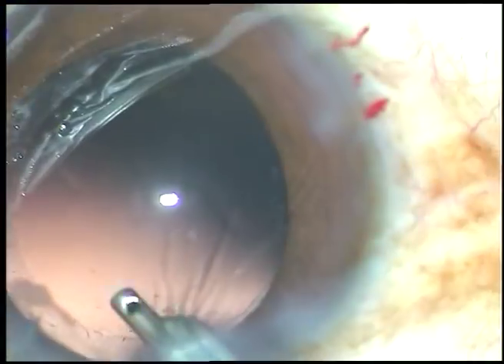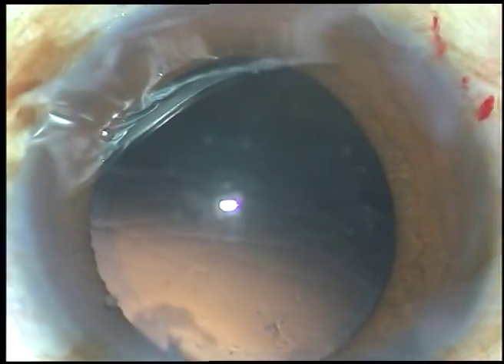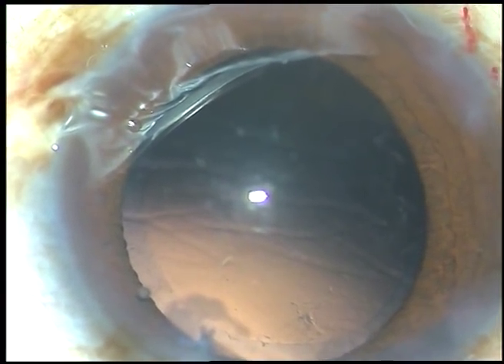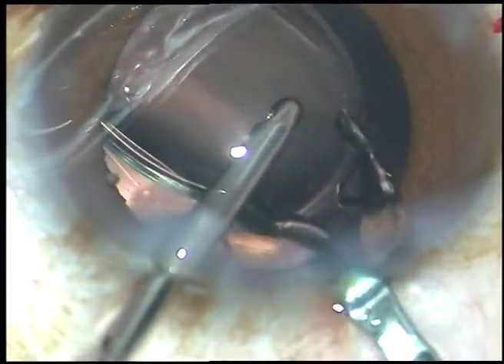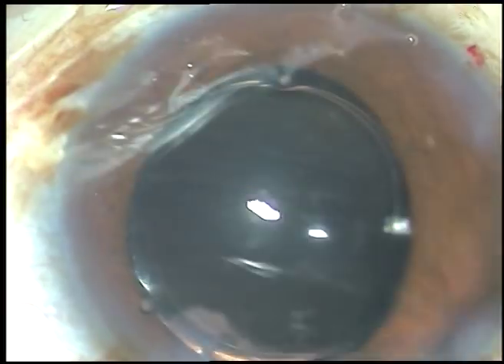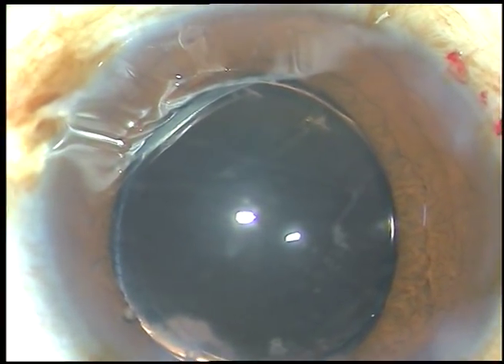In this case, we have selected a hydrophilic acrylic intraocular lens, and it is being implanted under irrigation. Irrigation keeps the anterior chamber formed and the lens is implanted. The irrigating probe supports the lens and pushes it into the capsular bag. The lens is now in the capsular bag.